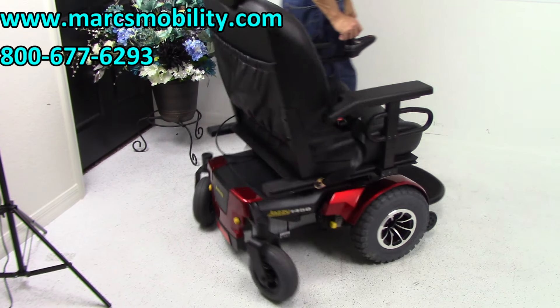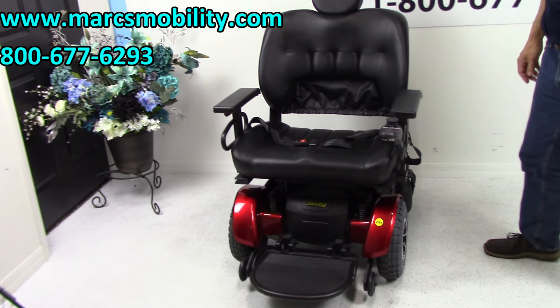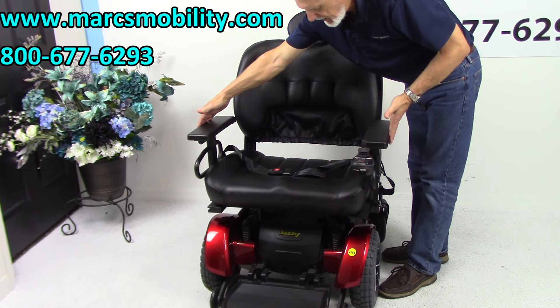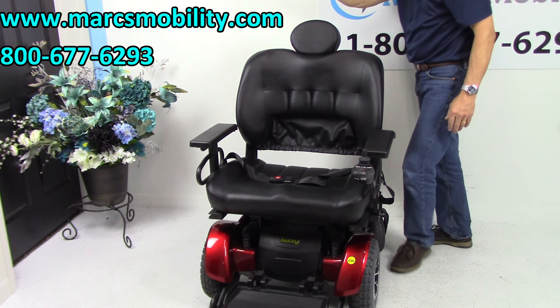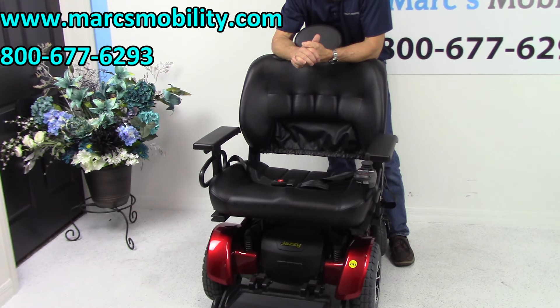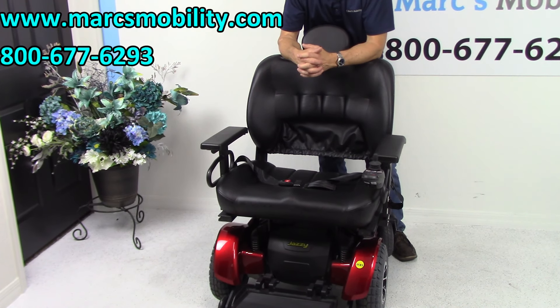One more important thing to know about this chair: the width from arm to arm is 31 and a half inches. So if you have doors that are 30 inches, it's not going to fit through. Make sure your doors are more than 31 and a half inches wide.